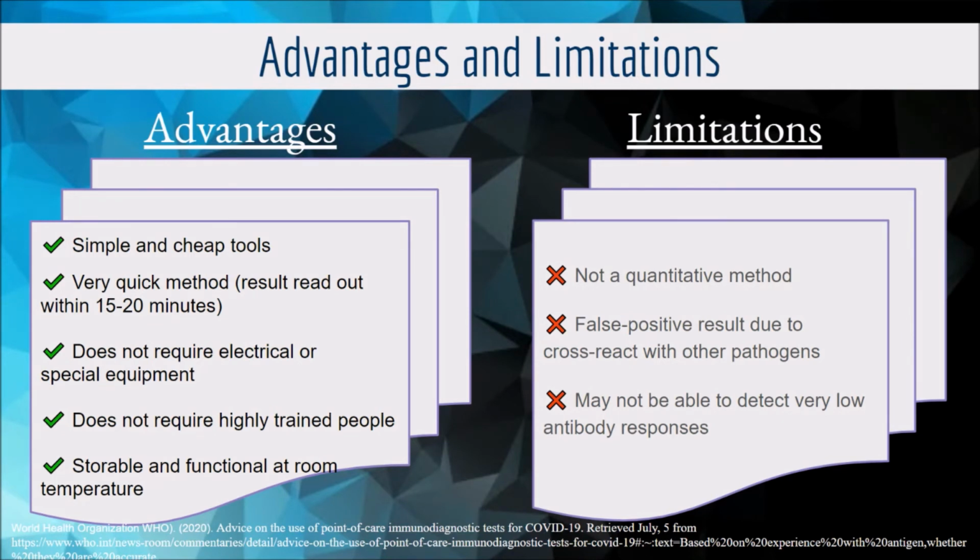So this RDT is easy to handle as it can be run without the need of any special equipment or electrical supply. Next, RDT also does not require any highly trained staff to conduct the test, as anyone who is knowledgeable or who knows how to use the tools correctly and read the result can carry out the test. And lastly, RDT does not require a certain temperature to store the device, and the test can be run at room temperature, which facilitates testing outside of laboratory settings.